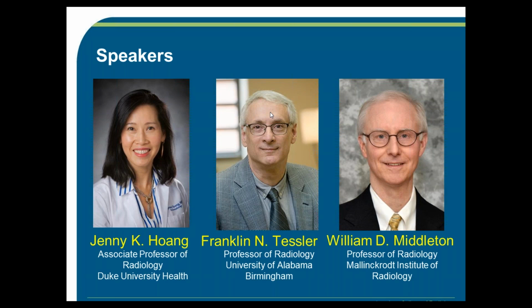Three of us came together at RSNA, and we really felt strongly that we were on a mission to change the way thyroid ultrasound is performed. We wanted to change the management of thyroid nodules for patients and also add to the value of radiologists and other providers. And this is why we were motivated to do this webinar. We were not asked to do it. This is through our own initiative because we really feel strongly that the next step forward is to share what we know and what we can do with you.